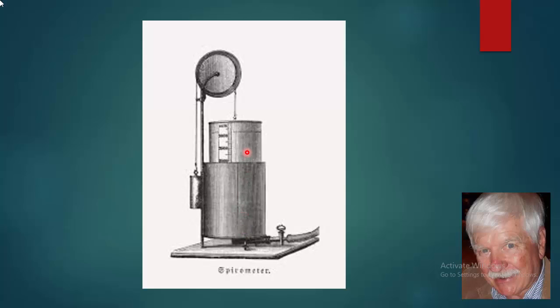It basically can only be used for measuring vital capacity, which I'll show you in a minute. Vital capacity is very important, but you need to know the other volumes too. But it's a good, quick, easy, and inexpensive way to measure a vital capacity of the lungs.